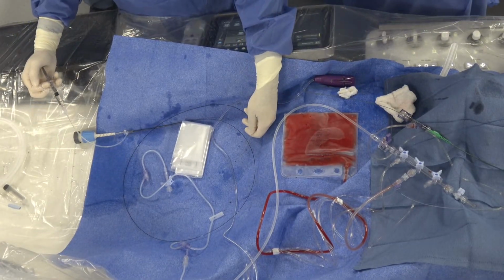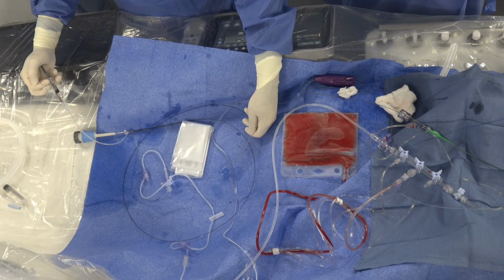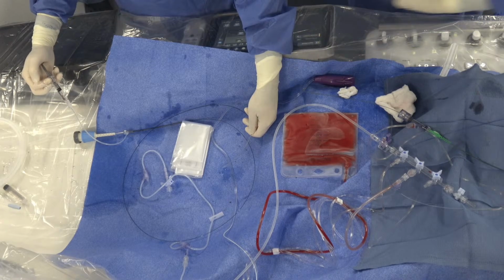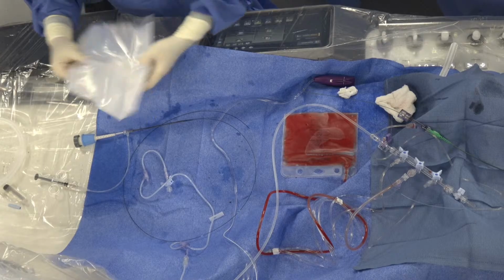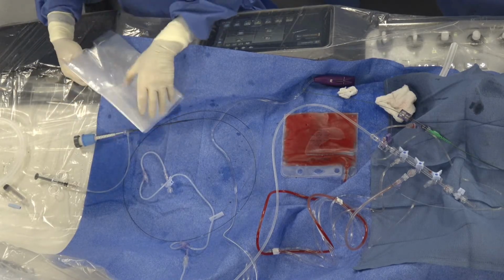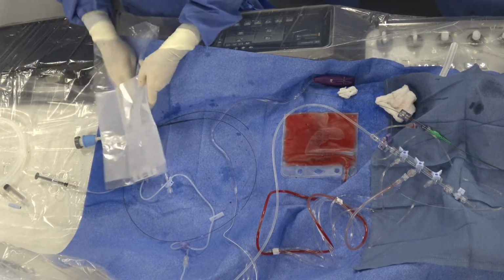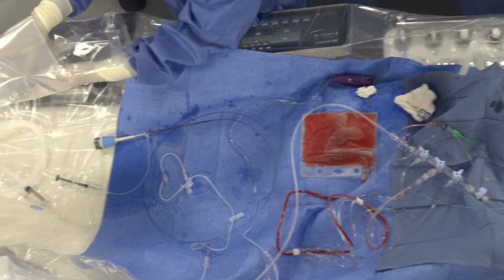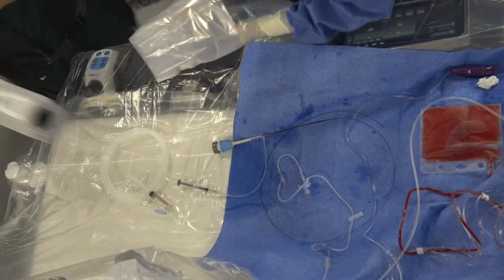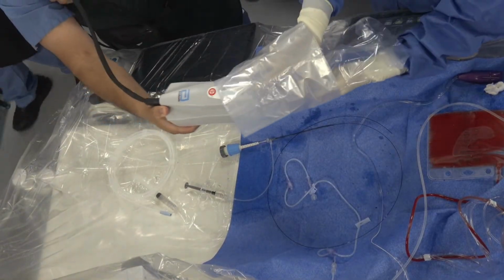Like she mentioned earlier, we already flushed it and we could see a few drops and bubbles coming out. Now, Asif is going to give us a console. This plastic comes in. So you have to know exactly where. You see how his hands are going. Come underneath. The ceiling camera is not seeing it. Yeah. So the console is coming in.